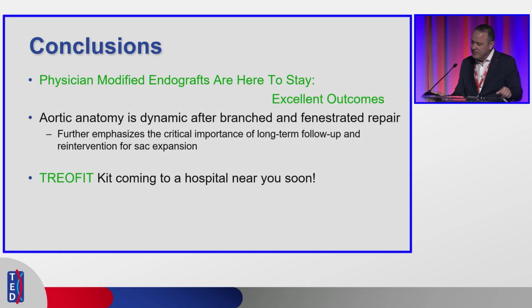In conclusion, physician-modified endografts are here to stay. Everybody is getting involved in this. Aortic anatomy is dynamic after branched and fenestrated repair, and it emphasizes the critical importance of precise planning, but also long-term follow-up.